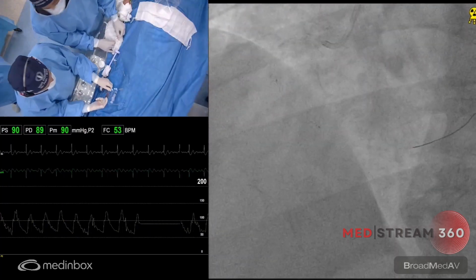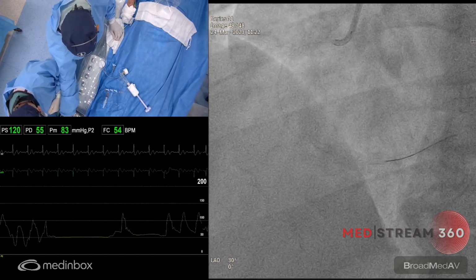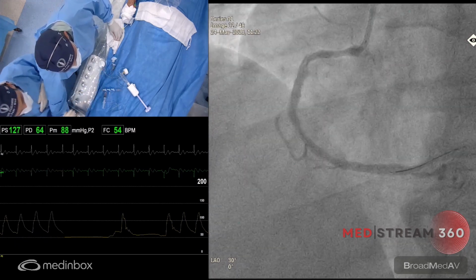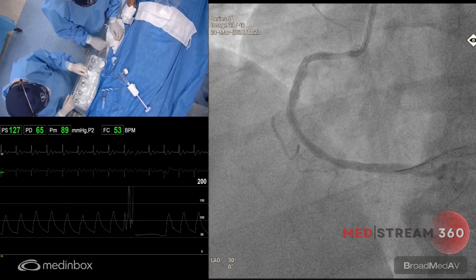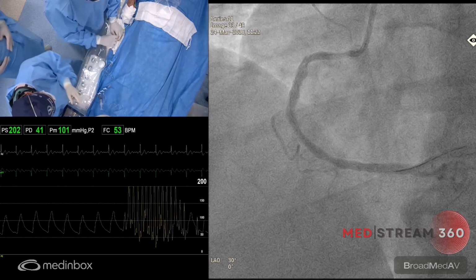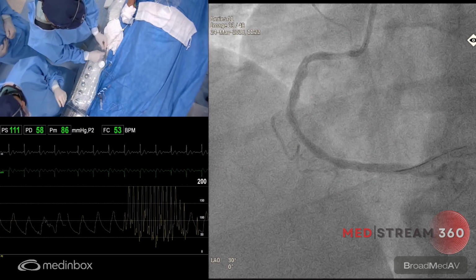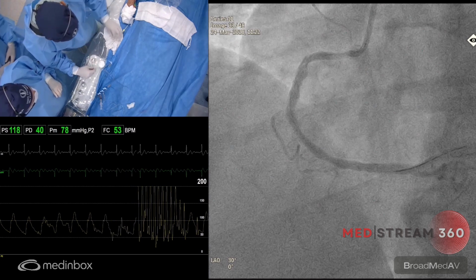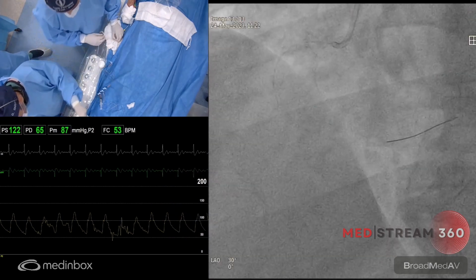Also, we have some difficulty to cross the lesion. The complications depend on your technique. If you use an oversized balloon, you can get a dissection. But if you use an undersized balloon, the complications are rare with IVL. Is that correct? Exactly, and we don't see descriptions of rupturing, because you're applying the sound wave pressure, causing the fracture more in the superficial tissue.